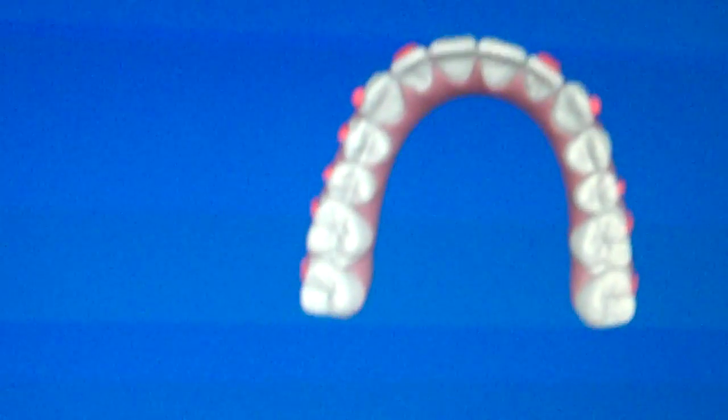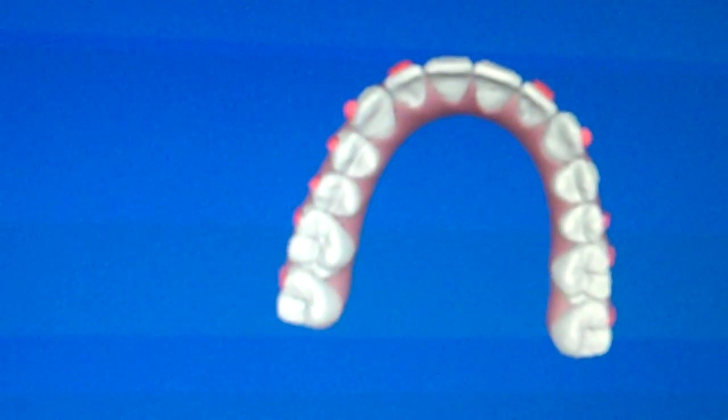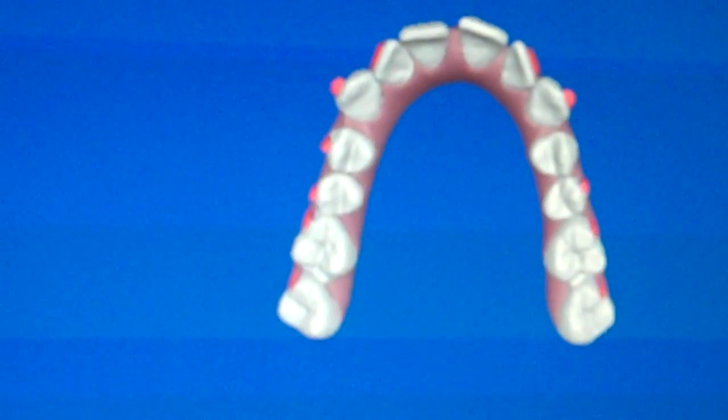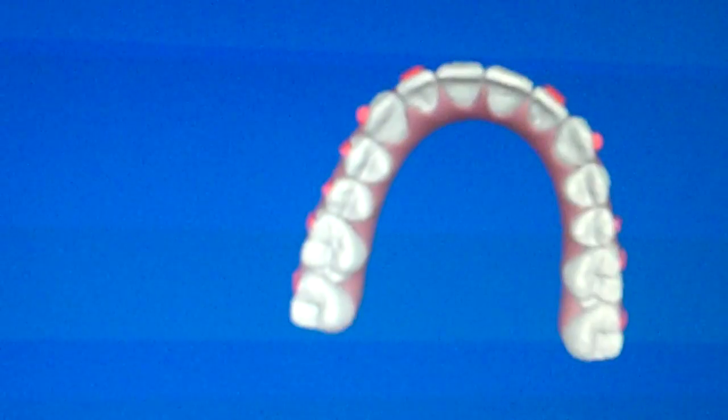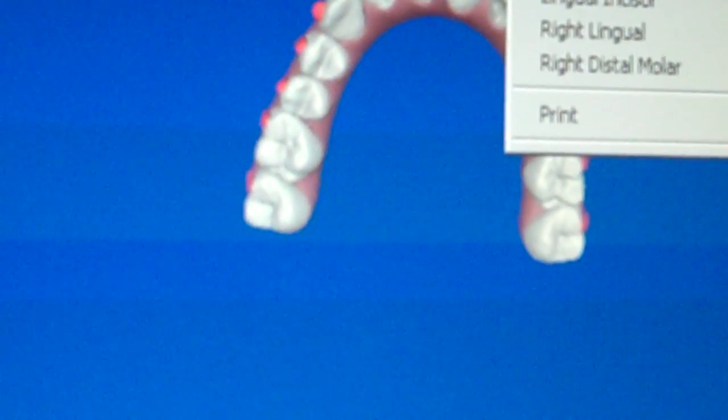That's what's causing the overbite. That is amazing. That is cool. I can't wait — it's looking fun.